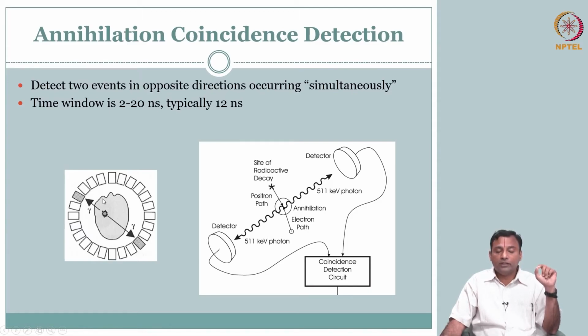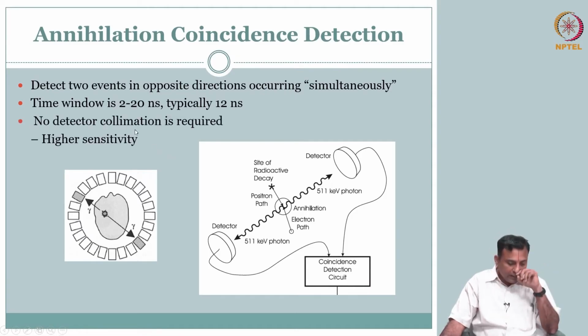So, now because of this, I do not need to worry about my collimator. This circuit is going to help me get as much signal within the photons that are detected. What are the true photons that we want to worry about? That is ensured based on this window threshold, and therefore your sensitivity increases way better.